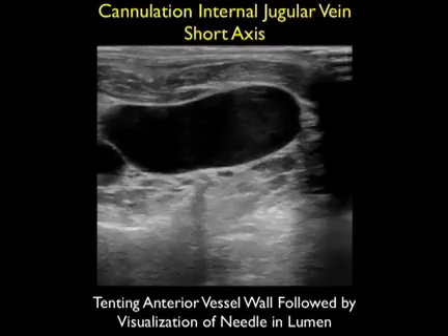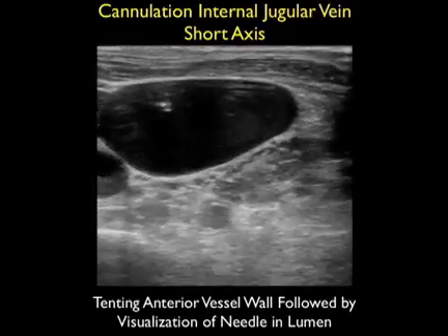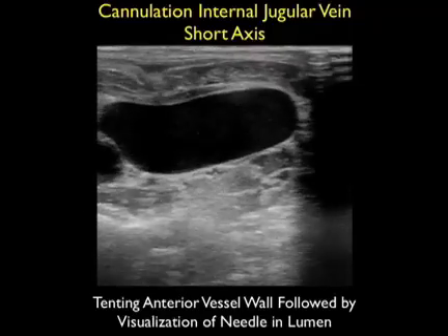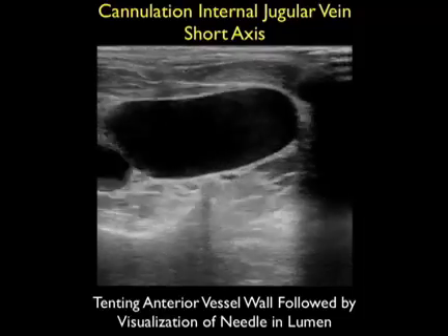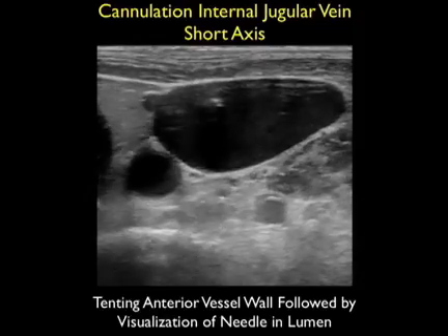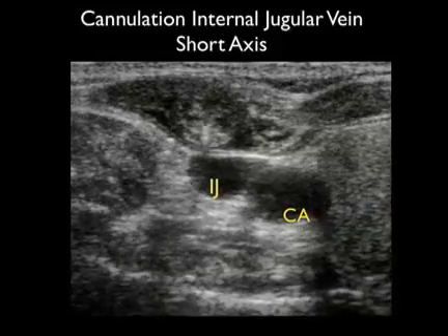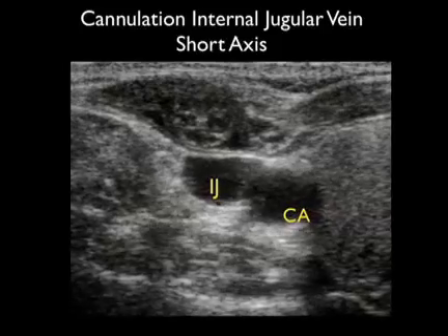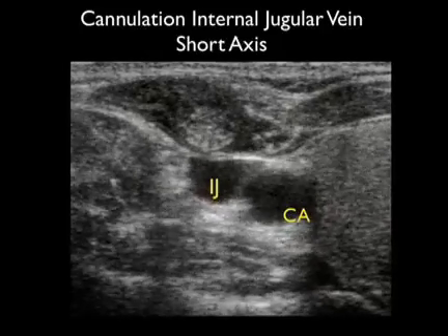Here's an actual cannulation of an internal jugular vein. Notice that we see the deflection of the anterior wall of the vessel as the needle pushes down on that wall, followed by the appearance of the echogenic tip of the needle within the lumen of the vessel. Here's a different patient receiving a central line — in this clip we can actually visualize the echogenic needle coming from the surface and going all the way down through that anterior wall of the internal jugular vein to park directly into the lumen of the vessel.